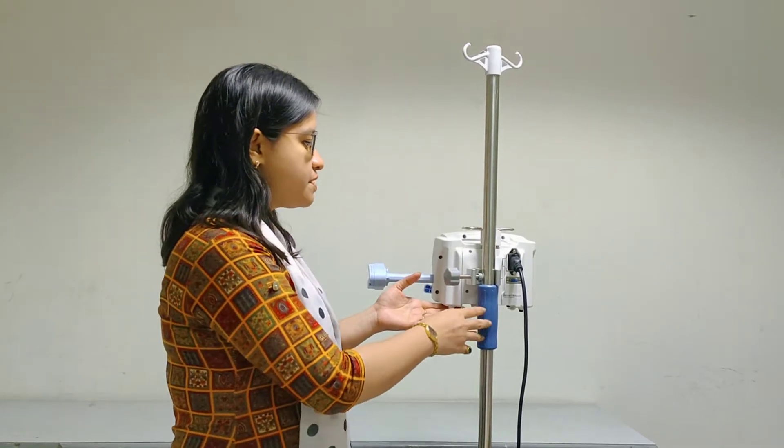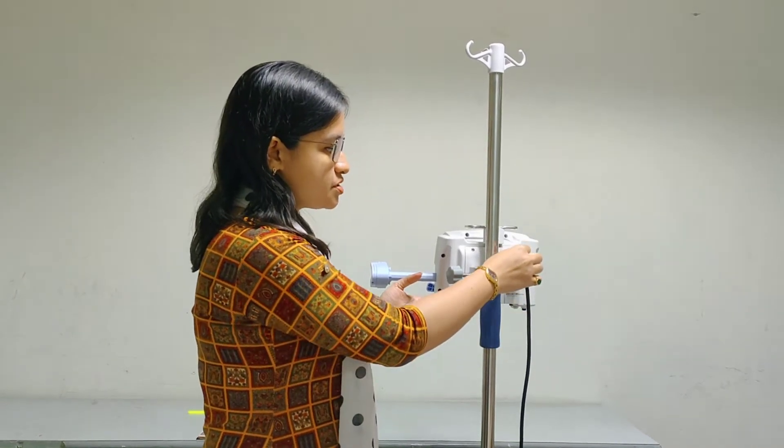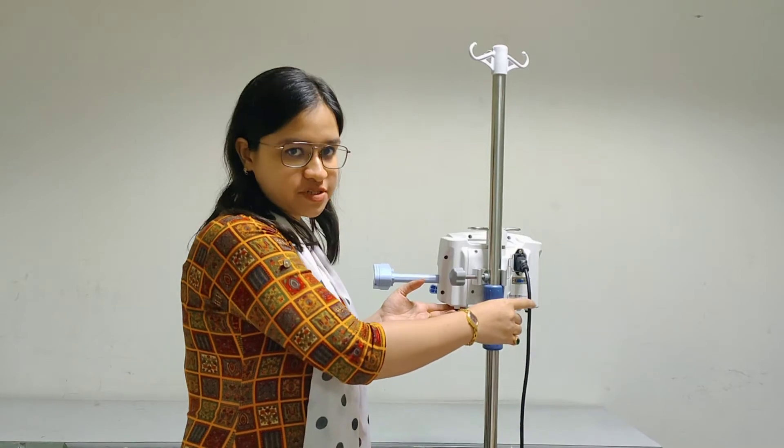This is the back side of the syringe pump where we have the pole clamp. And this is the power cord which is attached to the mains for power supply.